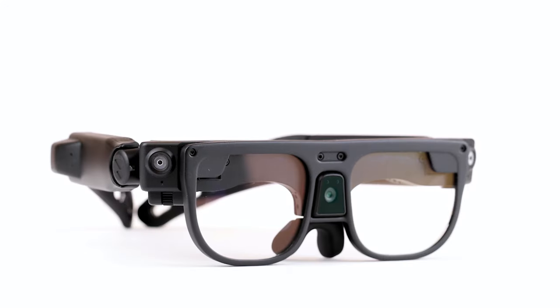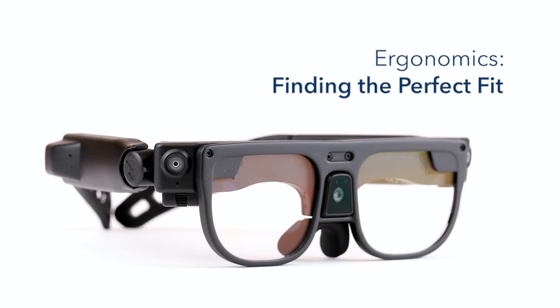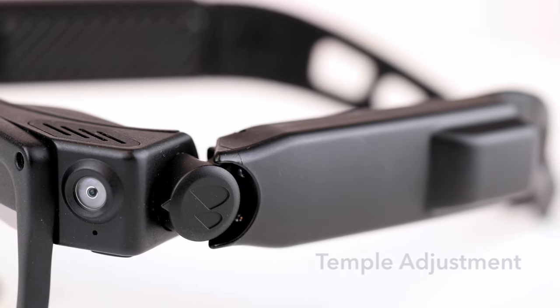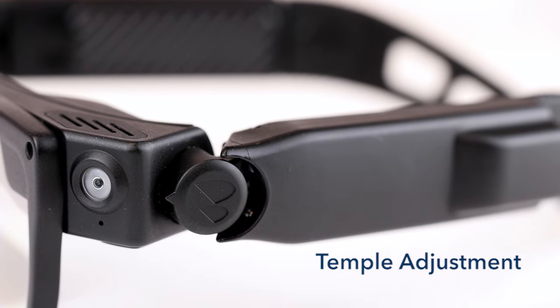Before you get started using Argo, there are a couple of adjustments you should make to ensure you have a comfortable and secure fit. First, you want to adjust the tension on the hinges, which will change how far the arms open.